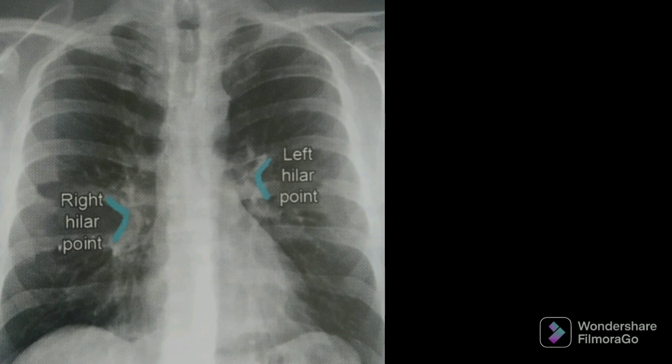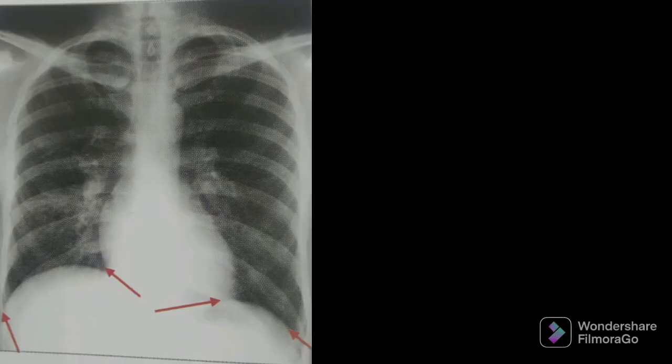Next, we are going to discuss the diaphragm. The diaphragm is dome-shaped. We have the right hemidiaphragm and left hemidiaphragm. Contrary to the belief that the right hemidiaphragm is higher because of the liver, the fact is that the left hemidiaphragm is lower because of the heart — its size and gravity push the left hemidiaphragm down. Also look for the cardiophrenic and costophrenic angles, which can be obliterated because of fluid, fat, or fibrosis.